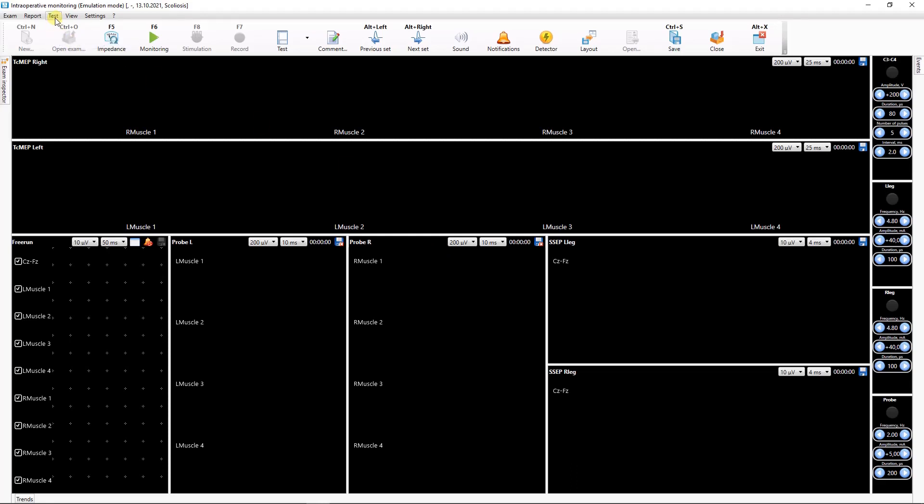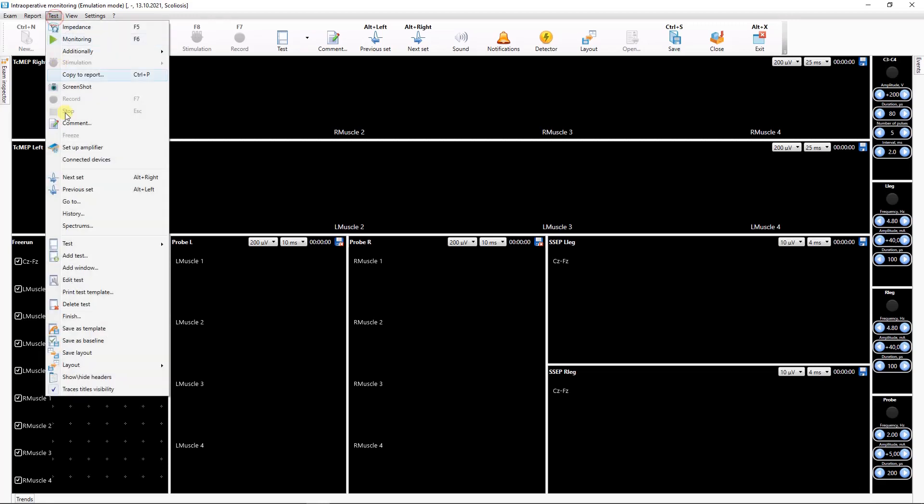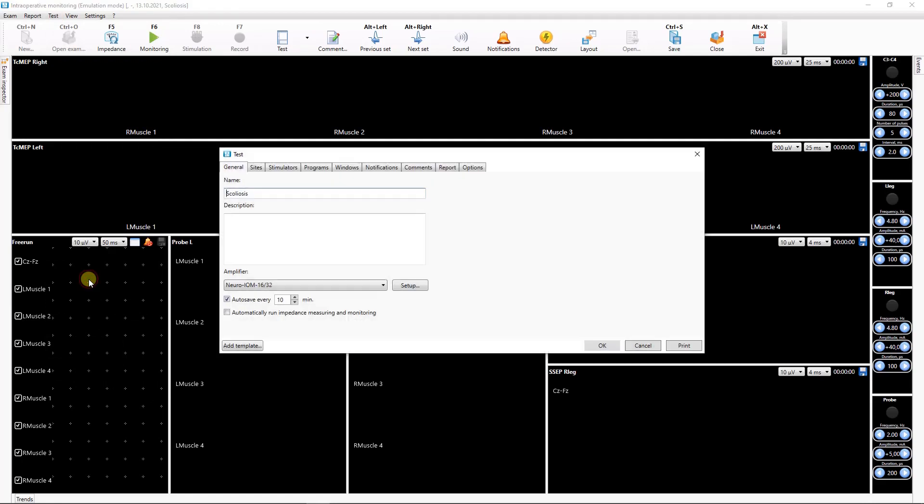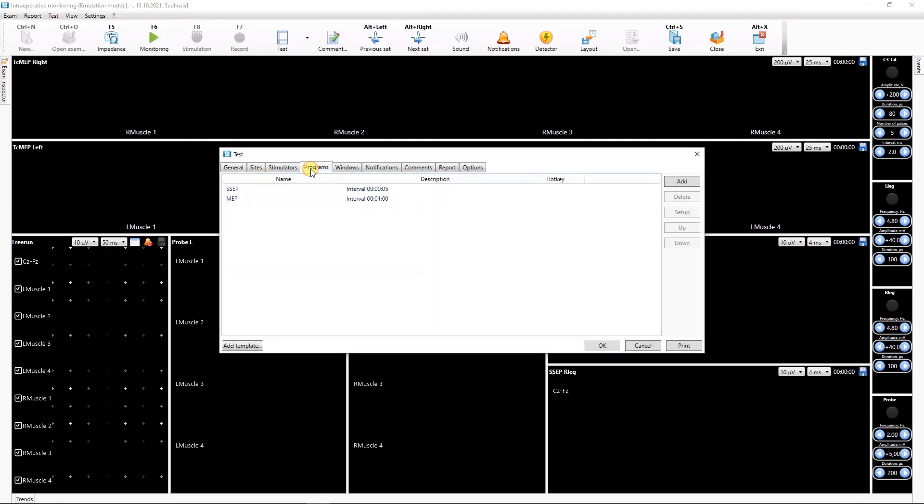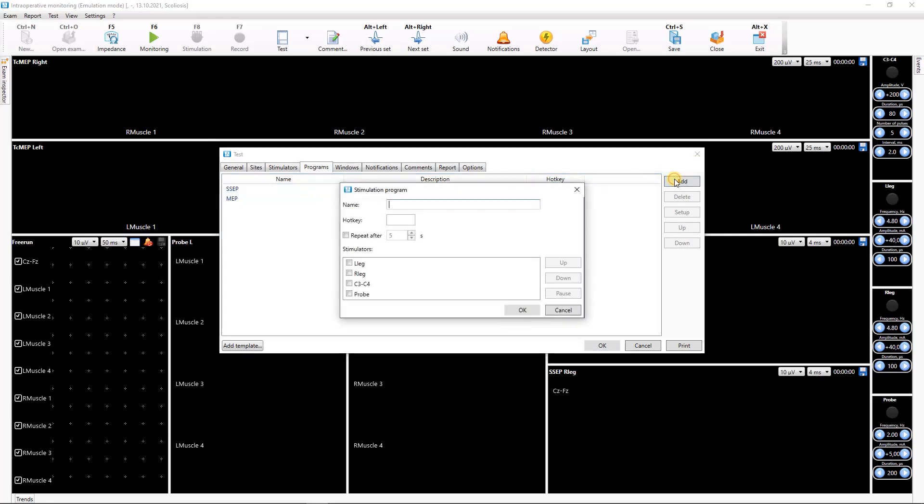To create new Stimulation programs or make changes to those existing, open the Test Setup dialog and go to the Programs tab. Here you can see the list of Stimulation programs, if any.